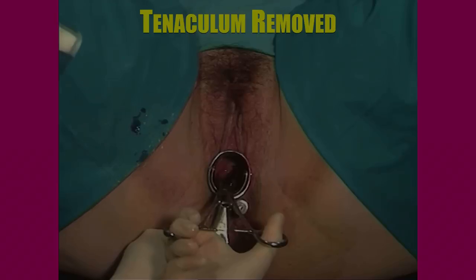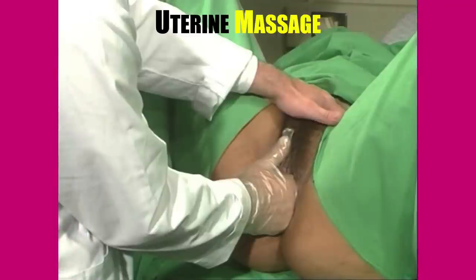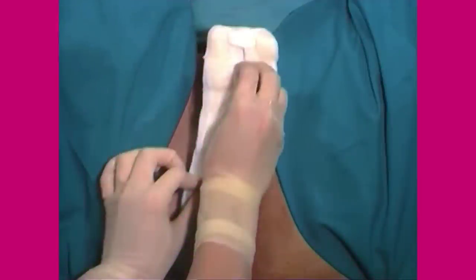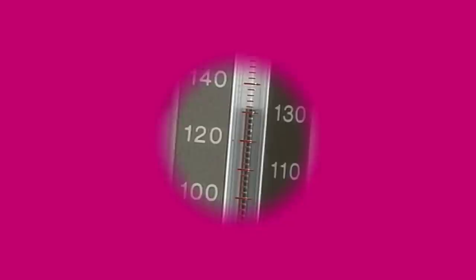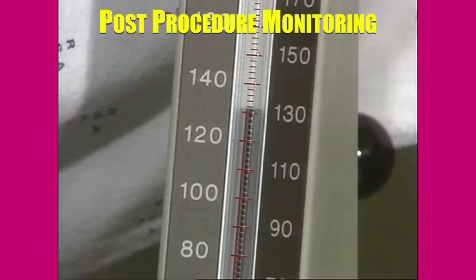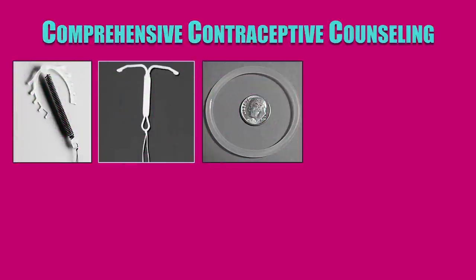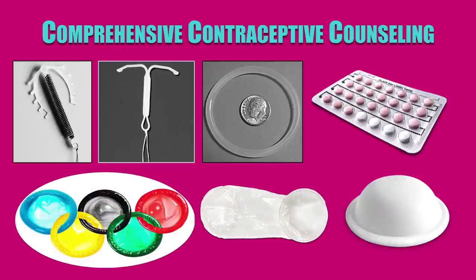Remove the tenaculum, clean the cervix once again with betadine solution, and lastly remove the speculum. I personally prefer to do a bimanual examination to massage the uterus and ensure that it is firmly contracted. A sterile pad is applied in the end. During the procedure, the assistant should monitor the patient's vital signs like pulse and blood pressure. The patient should continue to be monitored post-procedure for a few hours in the recovery room. The vaginal pads must be checked from time to time for any excess bleeding. The patient can be discharged on the same day. Comprehensive contraceptive counseling must be offered to the patient to avoid unwanted pregnancies in the future and the need for a repeat abortion.